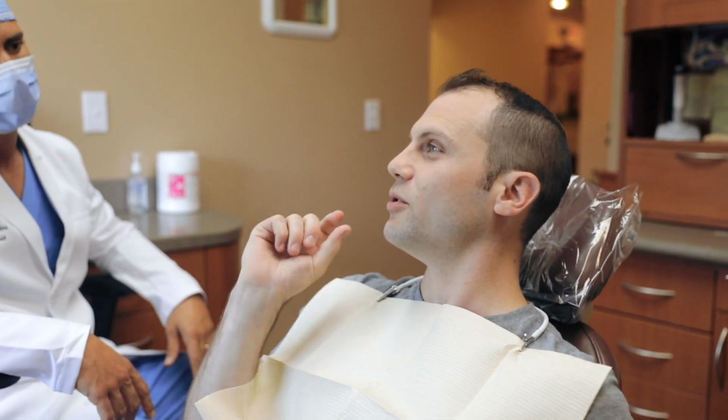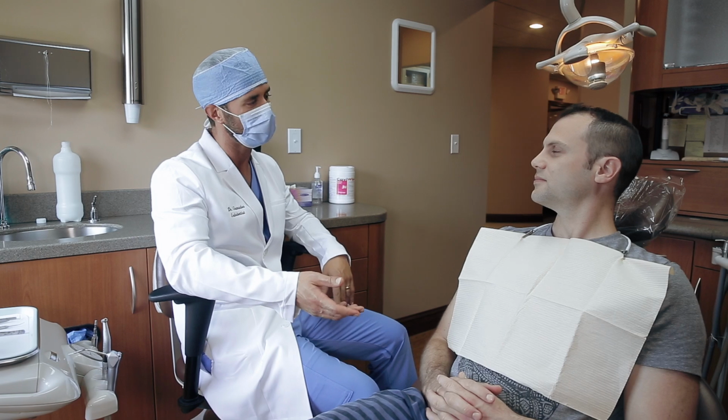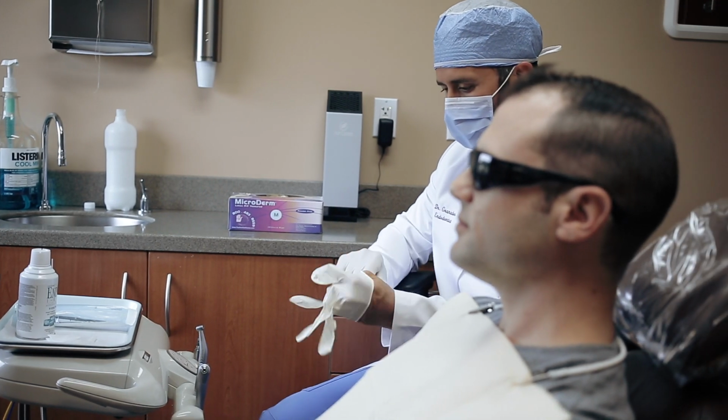Ideally, your assistant is going to acquire a bitewing and a PA in the area that your patient is telling them is the problem. Also, have your assistant get the long version of the chief complaint. This is key, so when your assistant comes to tell you they're ready for you, they can summarize the patient's chief complaint, which is going to allow you to be as time efficient as possible with your data collection. Also, train your dental assistant to bring any relevant medical issues to your attention at this point.